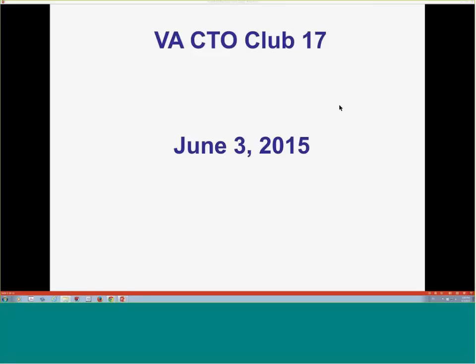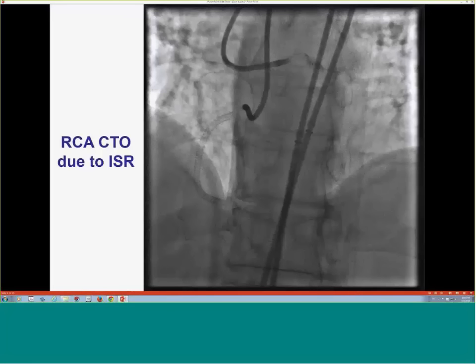This is the 17th VA CTO Club, and we'll discuss 3 interesting cases today pertaining to CTO interventions. So here's the first one.